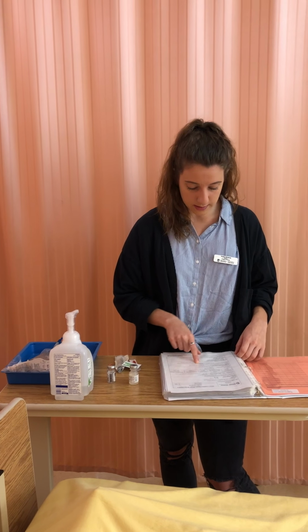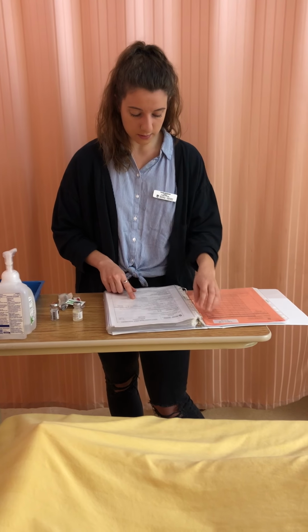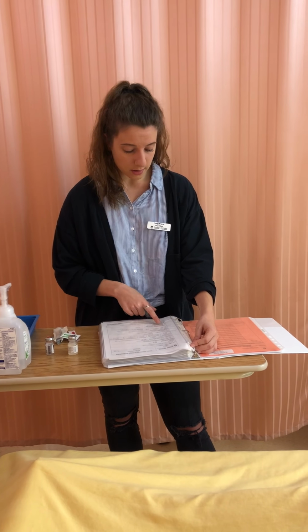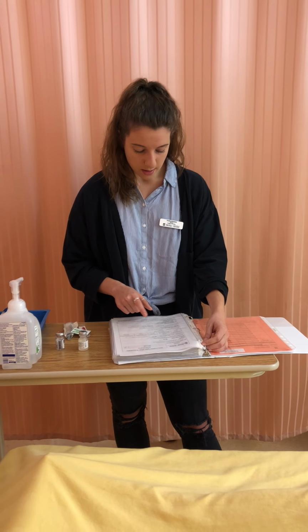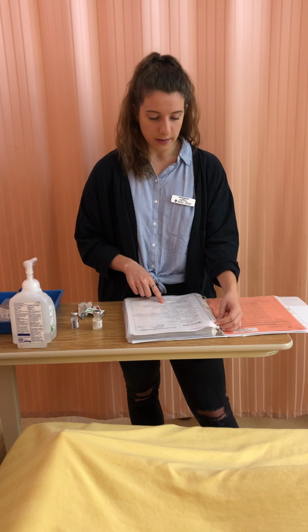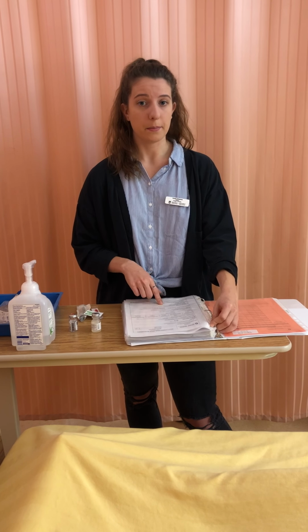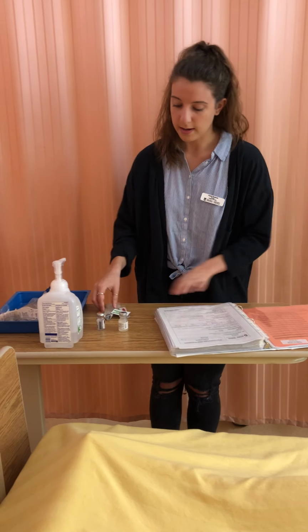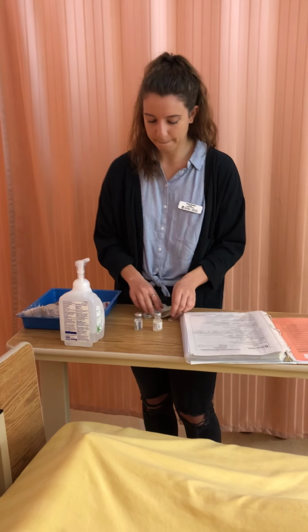So the compatibility is it's compatible with normal saline, so that is good. Also, the potential hazards that I would be looking for are nausea, vomiting, diarrhea, and abdominal pain. So I will assess my patient for that before and after. So now I'm going to go ahead and do my reconstitution.